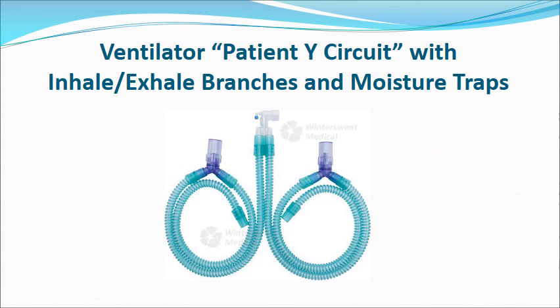Here's one example of a ventilator patient Y circuit with an inhalation and exhalation branch, and there are also moisture traps. Those little blue containers are designed to capture the moisture that comes from humidifying the air and condenses inside the tube, and if it has nowhere to go, it can actually clog the tube. So the caregiver has to be vigilant and make sure those don't fill and block flow, but the ventilator will give a warning if they do.